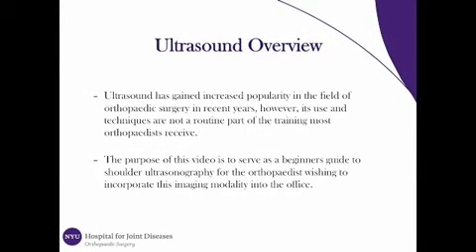Ultrasound has gained increased popularity in the field of orthopedic surgery in recent years. However, its use and techniques are not a routine part of the training most orthopedists receive. The purpose of this video is to serve as a beginner's guide to shoulder ultrasonography for the orthopedist wishing to incorporate this imaging modality into the office.